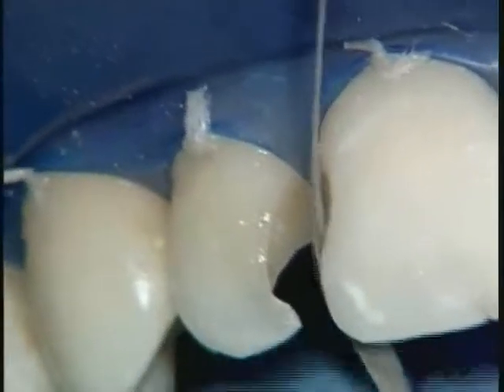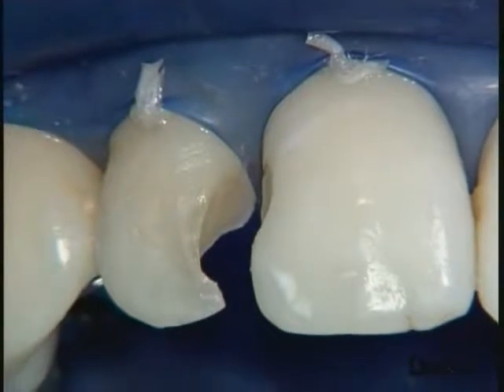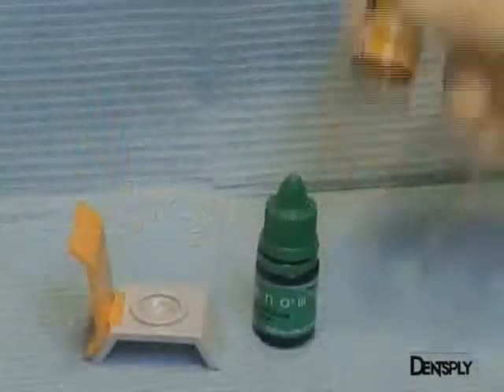On the central incisor, a small distal bevel is realised with the aid of a metal abrasive strip. Having completed the preparatory work, we can turn to the adhesive procedure. Here we are using Xen03, a self-etching adhesive.